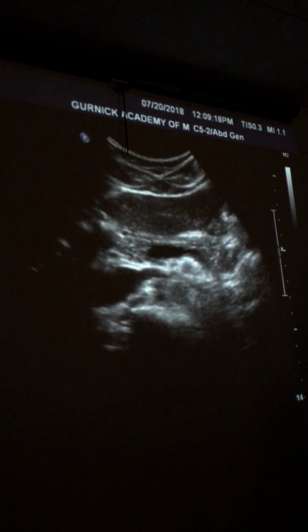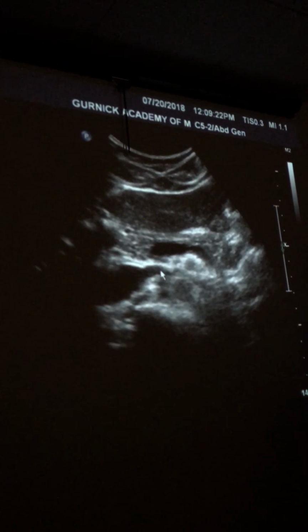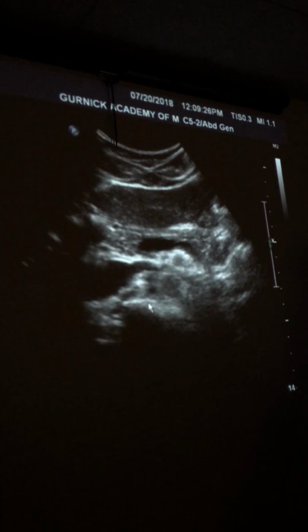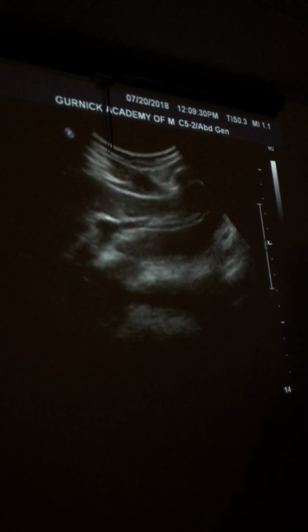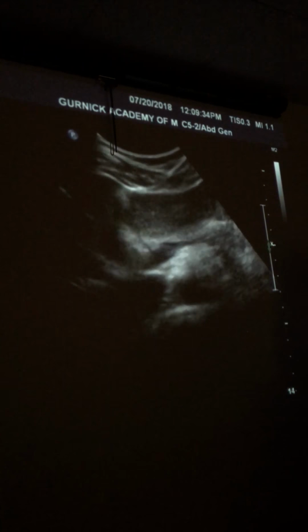Confluence, pancreas. IVC. What's this? Renal vein. Left renal vein. What's this? Okay. What's this? Spine. What's this? IVC, good. So a lot of you have been asking about the right renal vein.